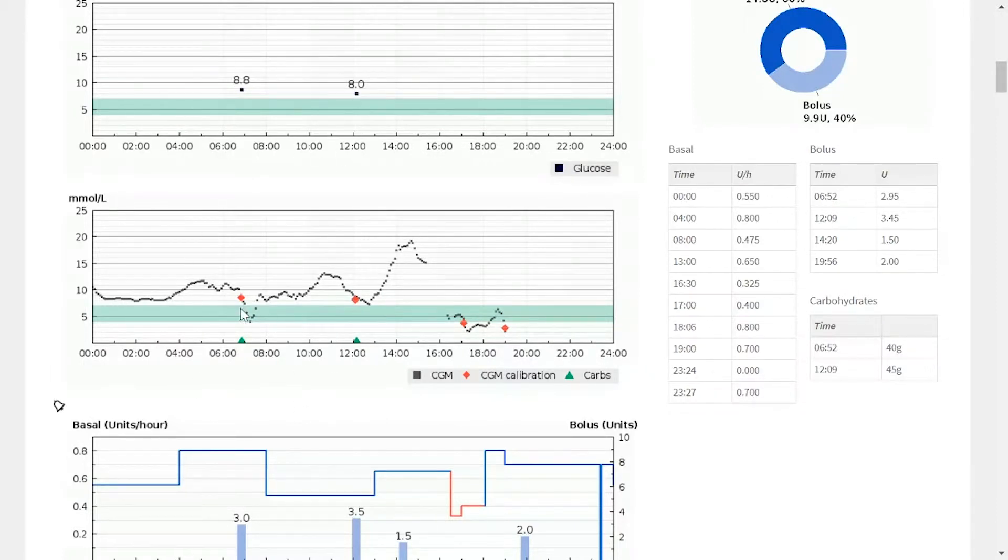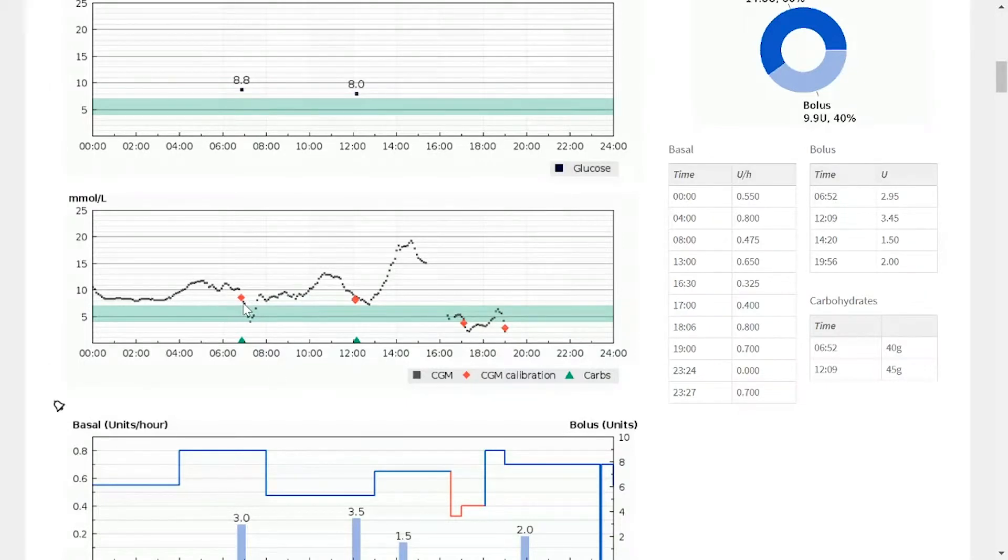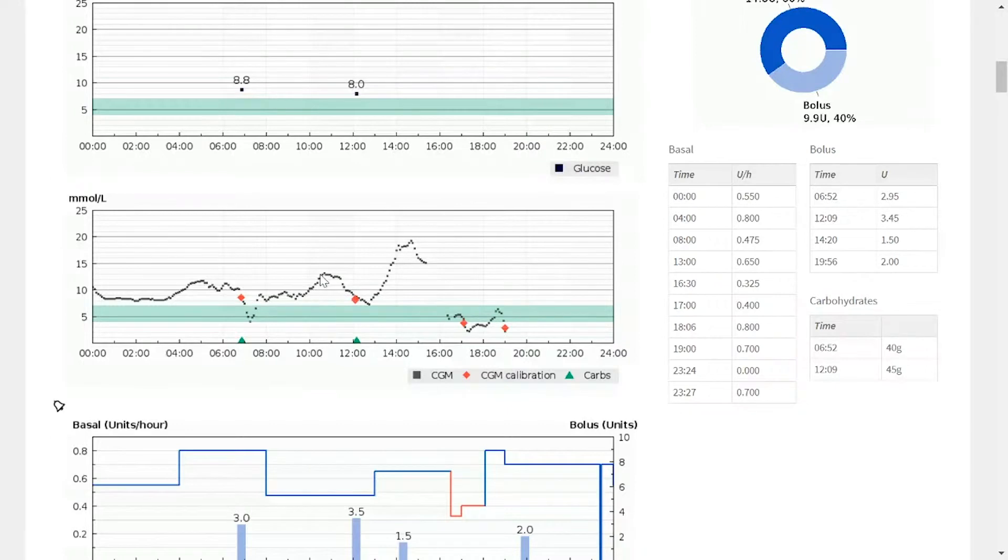The beauty of using CGM is you can actually see the impact of your decision further down the line. We can see that blood glucose rose and then fell again.